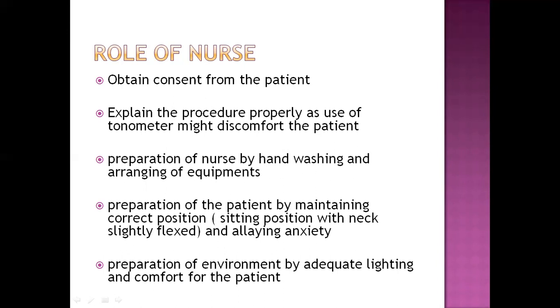Nurse should prepare the patient by maintaining correct position. Correct position for this procedure can be sitting position with neck slightly flexed and allaying anxiety. Nurse can prepare the environment by adequate lighting and comfort for the patient.